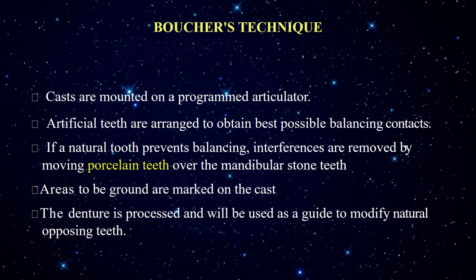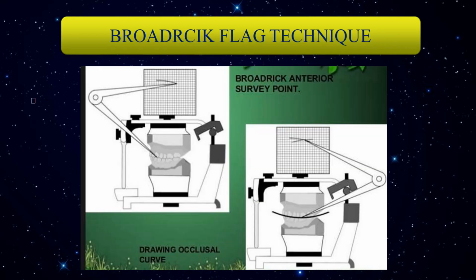Basically all of these techniques have some amount of arbitrariness involved, so they are not perfect. You have to keep doing it. It's like a trial and error technique, but the main idea is to remove any gross occlusal discrepancies, and if any teeth are severely super erupted, those teeth should be corrected.